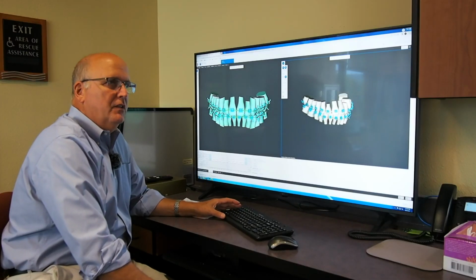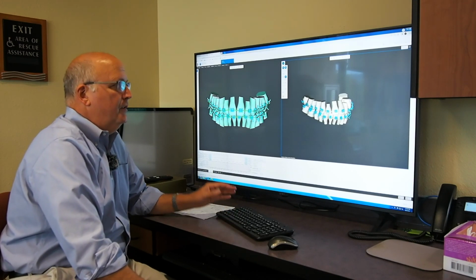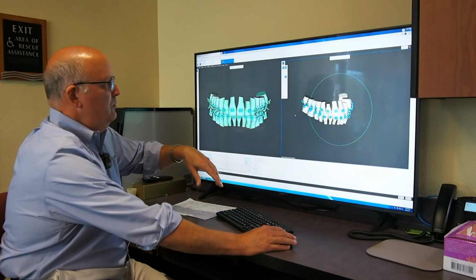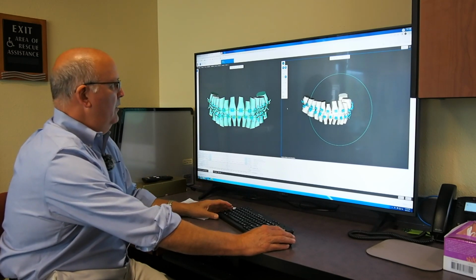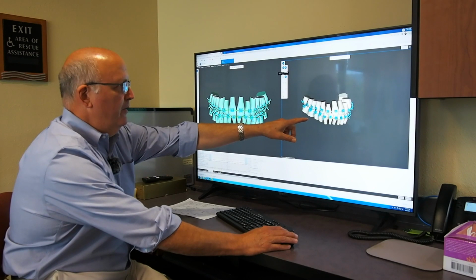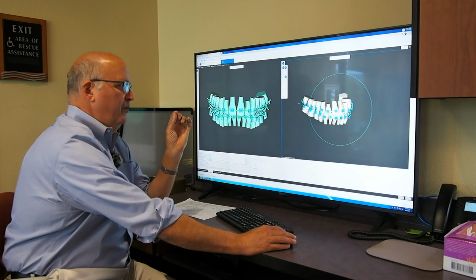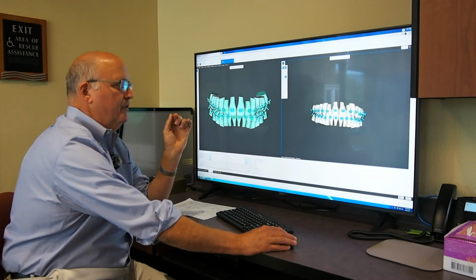Another piece of technology to help move teeth in the world of orthodontics is this one, which utilizes a scanned image, intraoral scanned image. The teeth are moved to a final position that is desired, and then a robot literally goes in and bends this wire to achieve all these movements in all 3 dimensions.